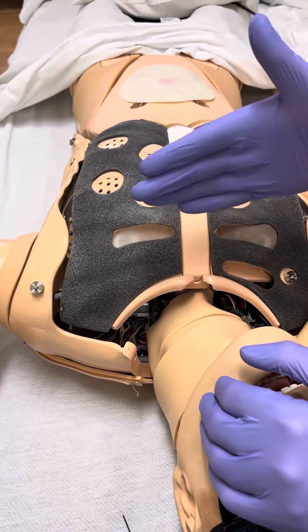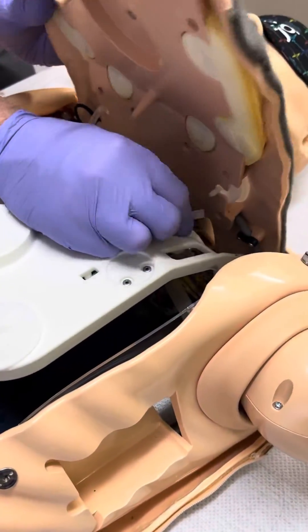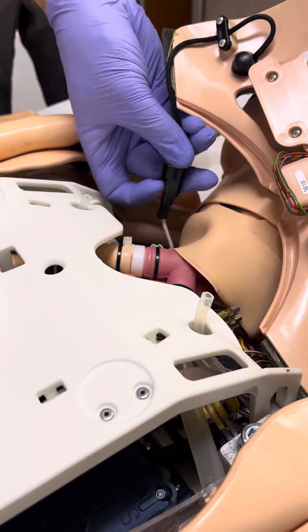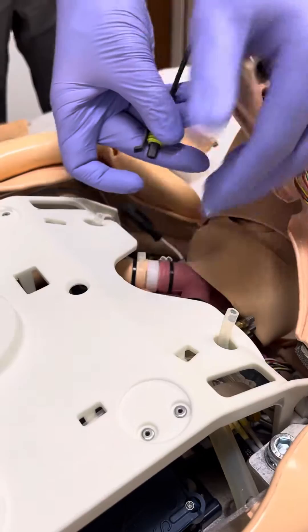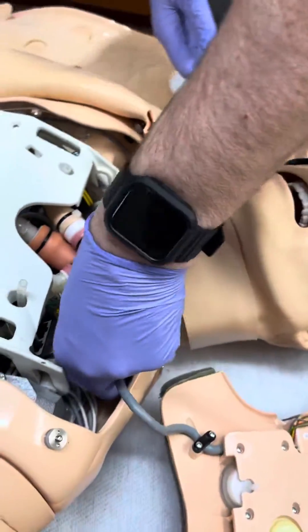What we want to do is lift the chest plate up. There are two hoses for the pneumothorax — pull those off — and then we're going to release the defib cable. Little tab here, lift up, and then just slide the chest wall over to the right — or rather, the patient's left.